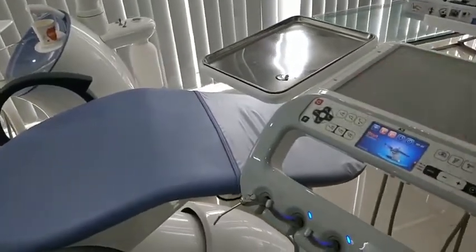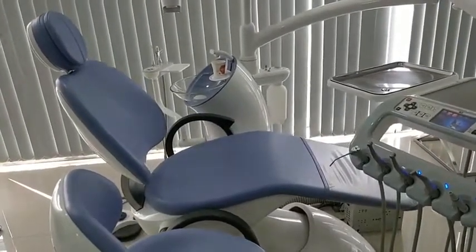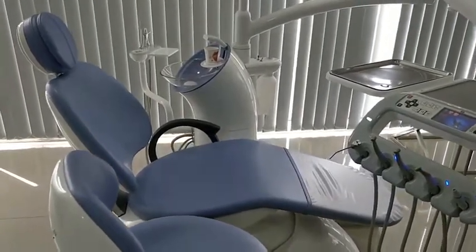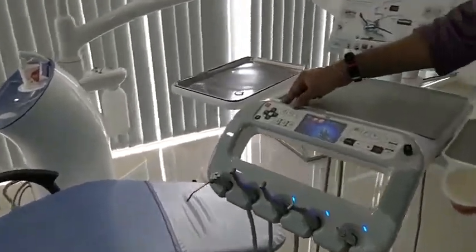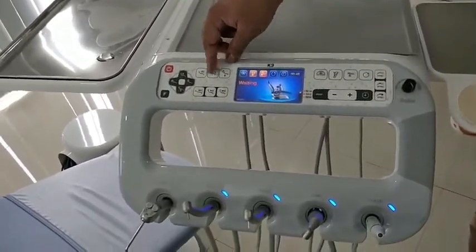There is also a position for the operating rest position, and a base zero position at ground level — used once the treatment is finished, or when the patient wants to climb onto the chair.